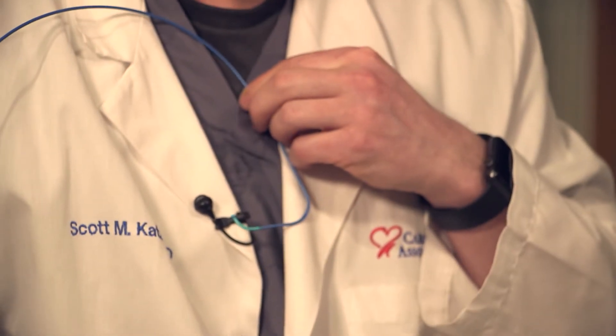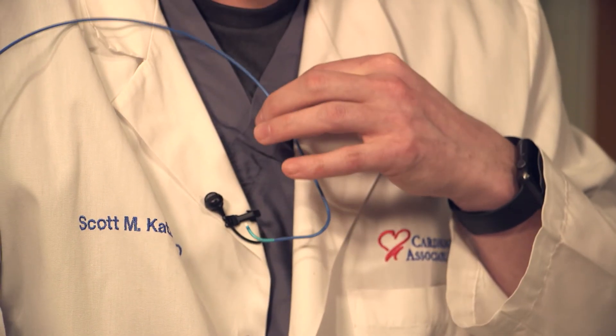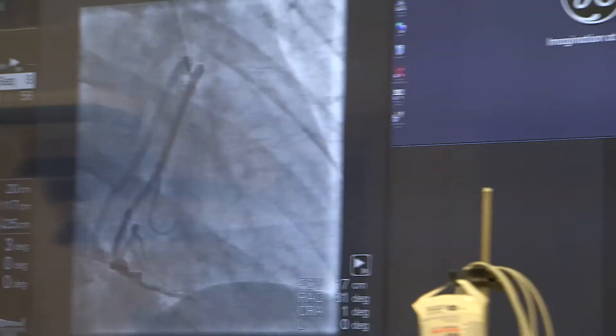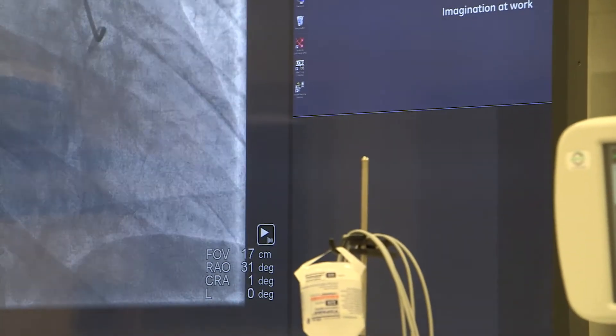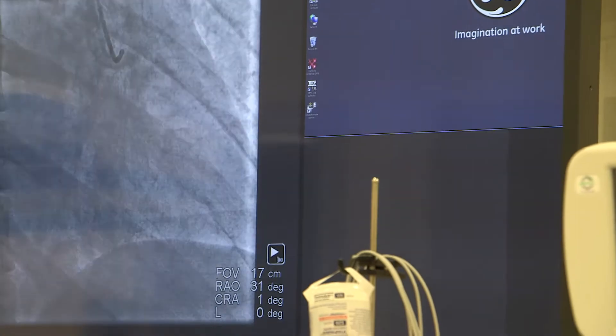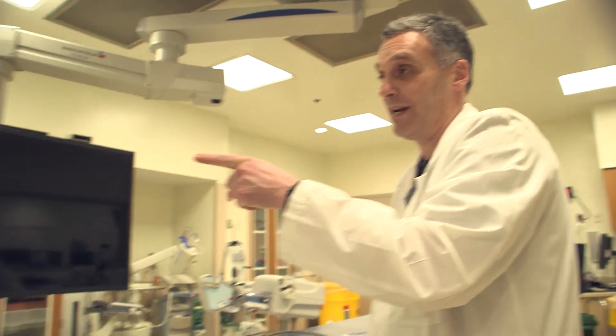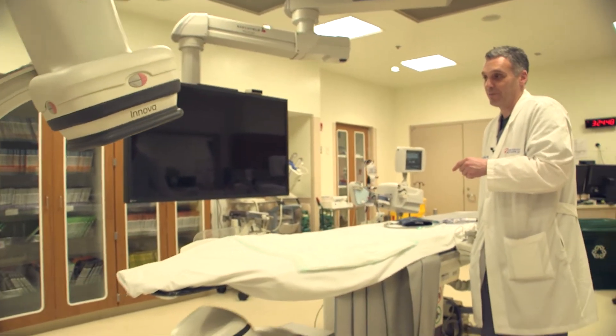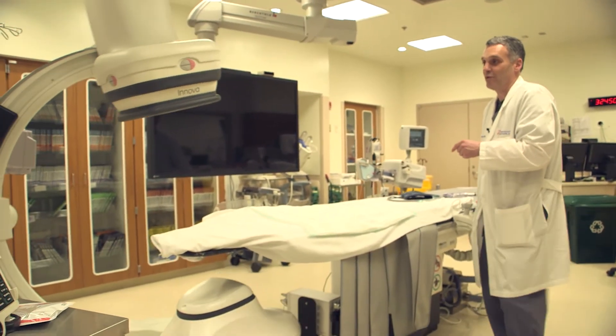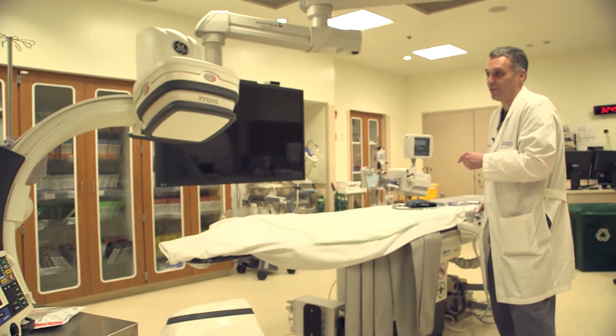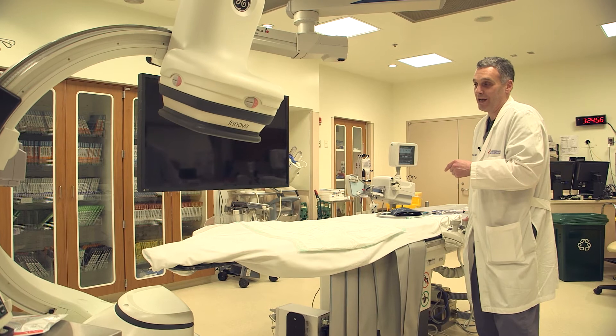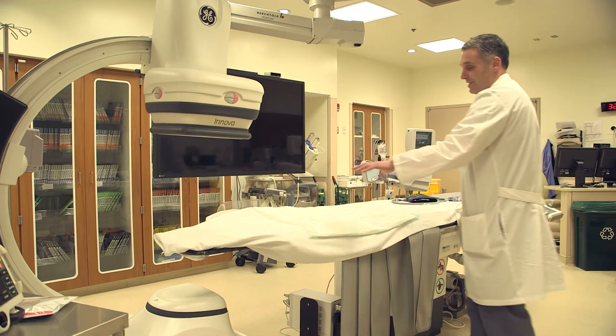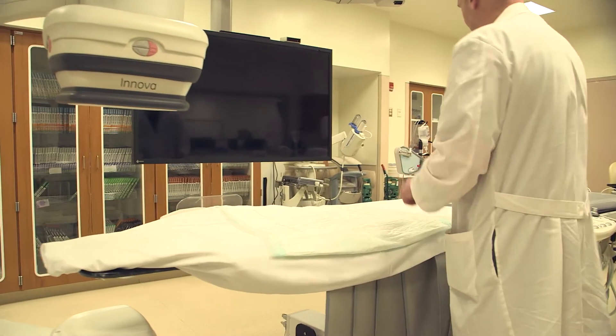The way we see them is not looking through the catheter directly but on this big screen sitting in front of me. We're taking video x-ray images of that dye as it fills the inside of the blood vessels. This piece of equipment here is the x-ray tubing and how we get our images. We can take different pictures by maneuvering this camera left and right to see exactly what's going on during the case. The patient's here and I'm doing what I need to do, watching everything on the screen.